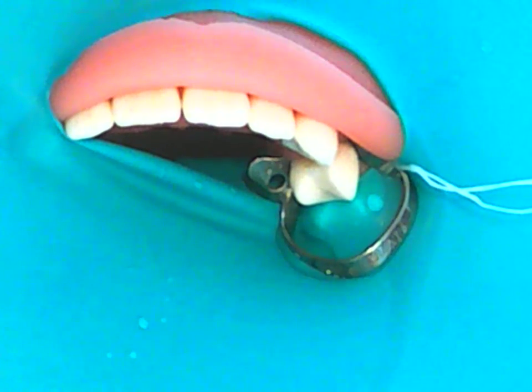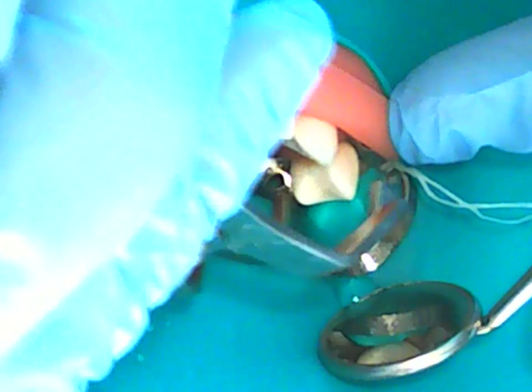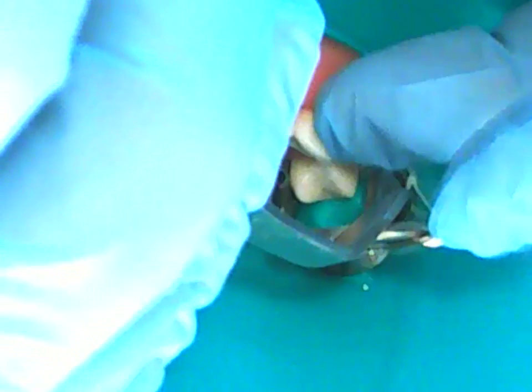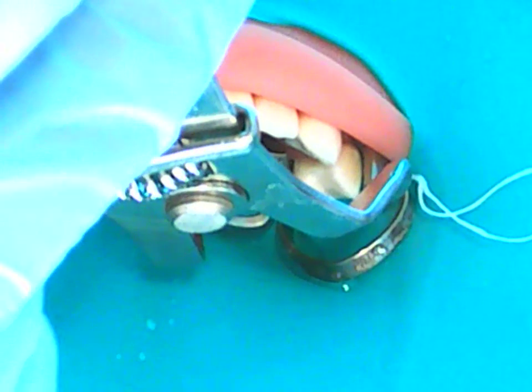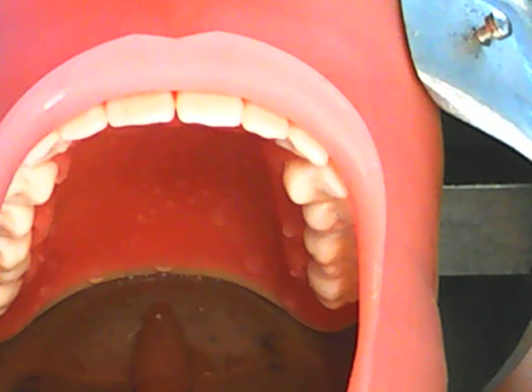Okay. At this point, you would use your dental dam forceps using indirect vision to find the holes. Place the beaks into the holes of your clamp. You need indirect vision for the lingual. You may be able to use direct vision for the buccal aspect. And again, my apologies. There you can see a little bit better. Squeeze your forceps to open up the clamp. You may remove it all as a unit, or you may drop the clamp at this point because it's attached to the frame and remove it as a unit.